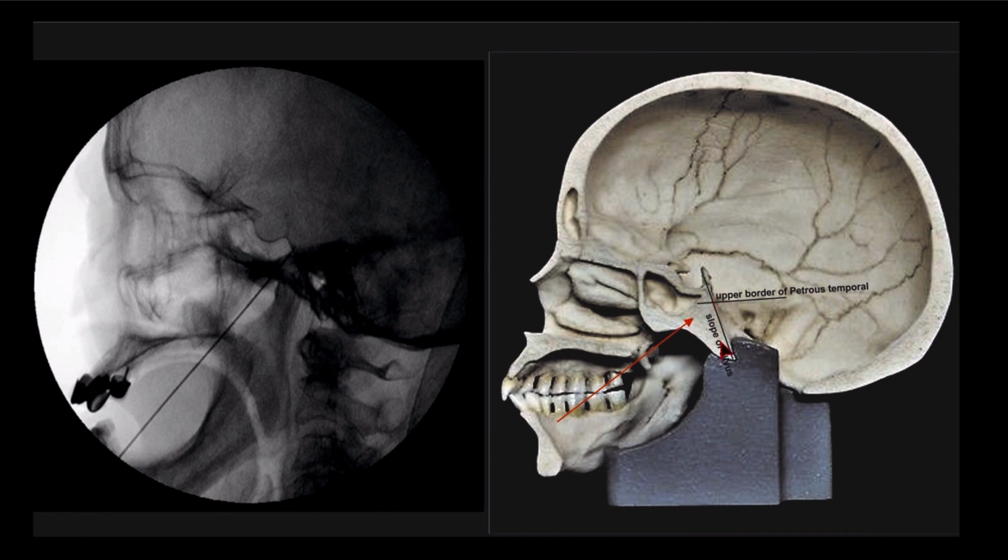See, the clivus is a little up because of this posterior clinoid process. So clivus and petrous junction. Towards this, you will get the foramen ovale. Clivus and petrous junction. Okay, needle trajectory is there. This is the zygomatic. Lower border of the zygomatic is at the level of the foramen.